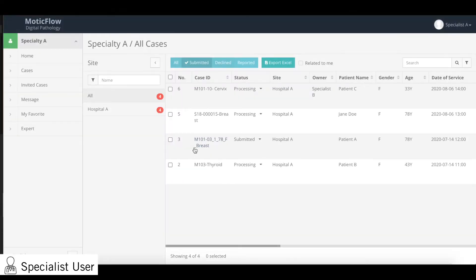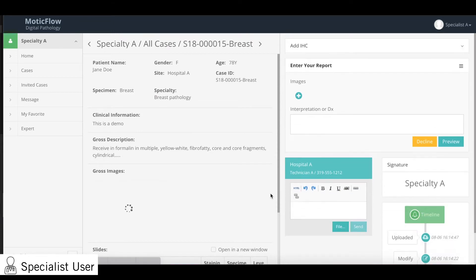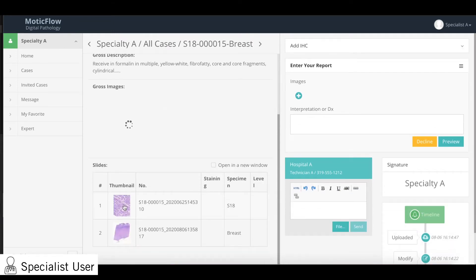Let's go into the specialist user view. As the consultant, you can collaborate remotely with referring hospitals using the Multic Flow platform. From the case list view, open up your case and view the relevant slide by clicking the thumbnail image.